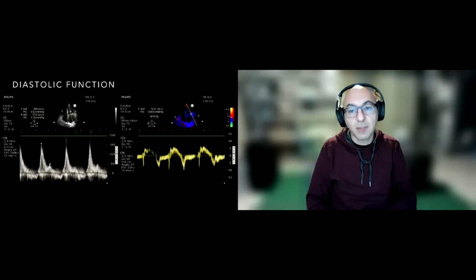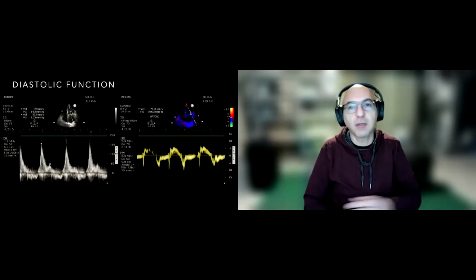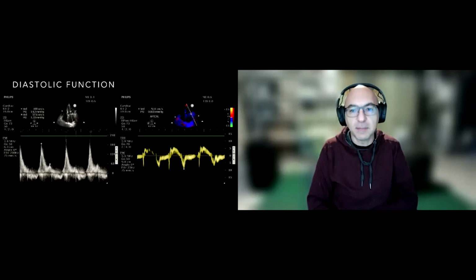Yeah, because high atrial pressure confirms that you're doing the right thing, while with low atrial pressure, or an estimate of the wedge pressure that is normal or low, you're going to diurese someone and end up with renal failure and hypotension. You will have to overreact and give them the fluid back, and it's not going to go in the right compartment anyway. It's not going to be the right kind of fluid, because we have colloids inside our vessels, and you're going to give crystalloid, so most of it will go straight to the lungs.